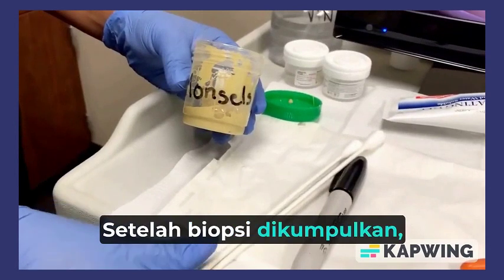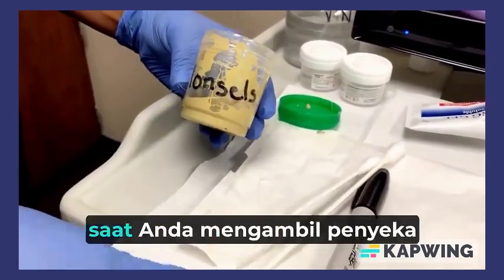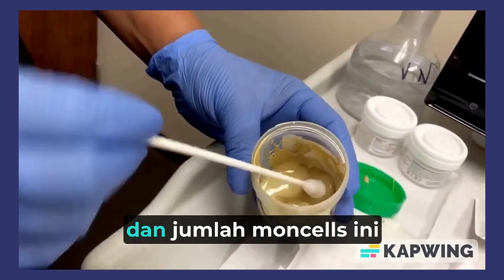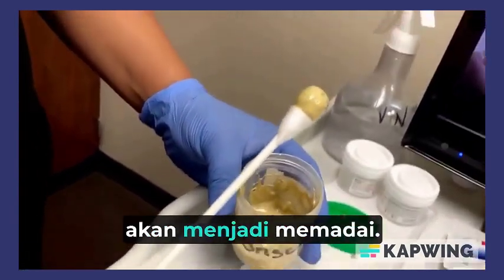After the biopsies have been collected, the provider will request Monsel's. That is when you take the OBGYN swabs here, place it into the Monsel's, swirl it, and this amount of Monsel's would be sufficient.